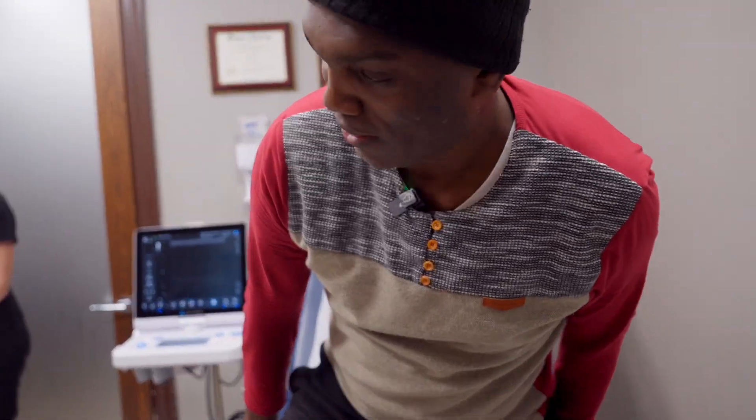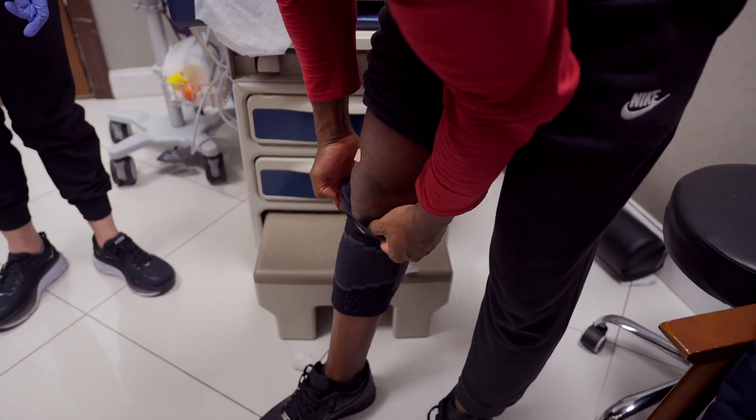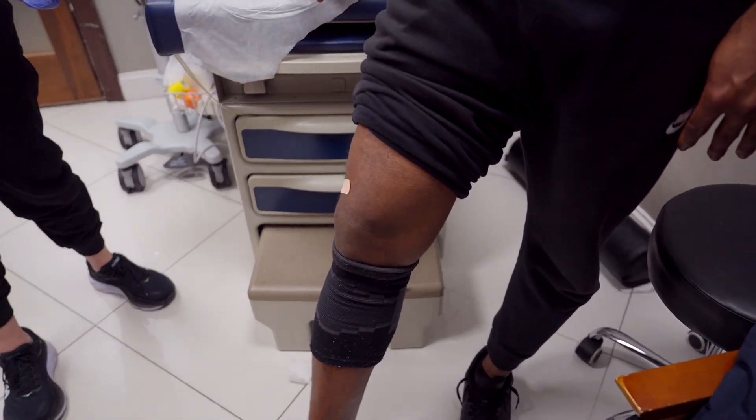Craig, how are you feeling? How's your knee? I don't know, once the fluid comes out, it feels okay. Once the fluid is drained, bend the knee, let me see. How's it feel? It's much better.